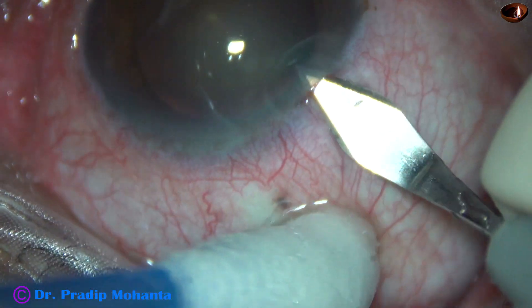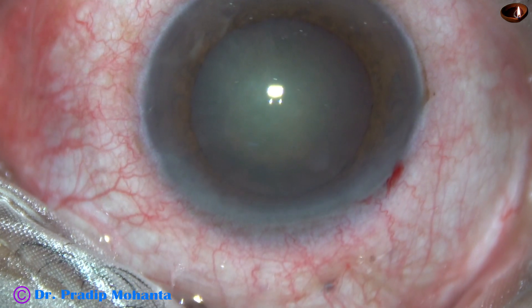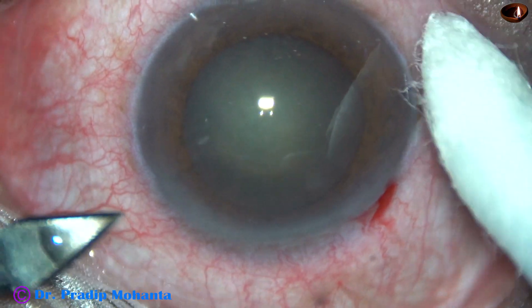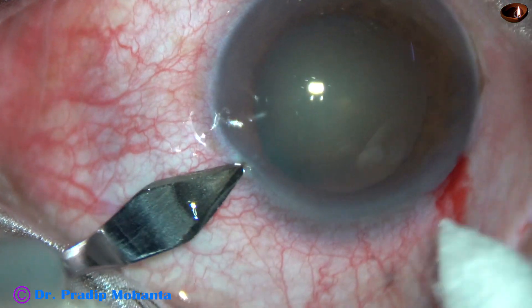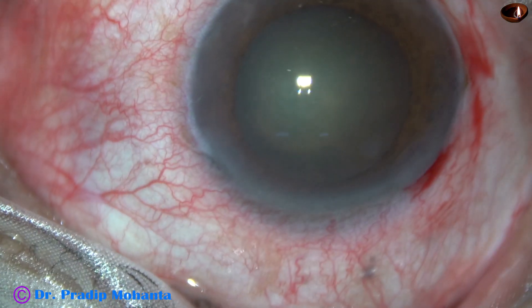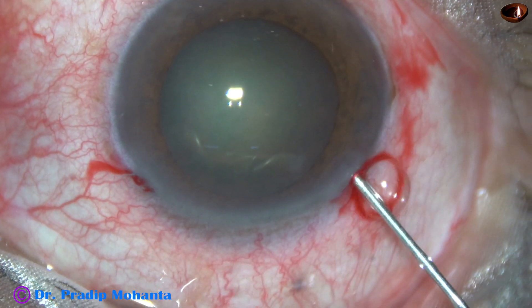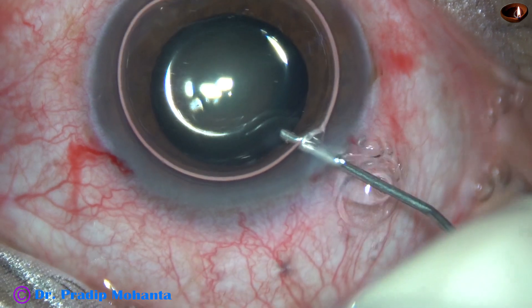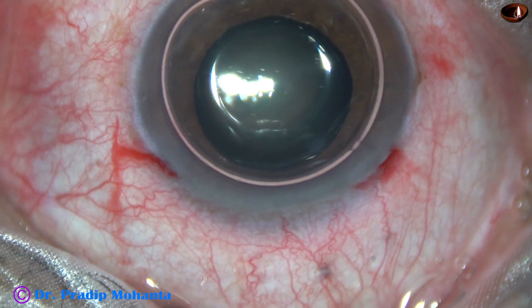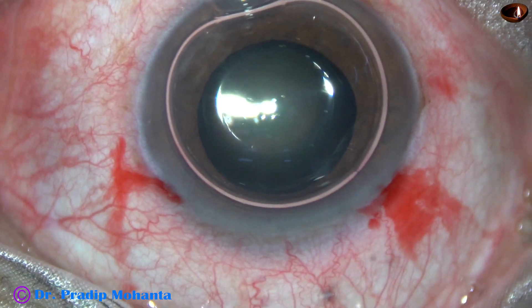This is the main incision with a 2.8 mm steel keratome. A sideport is made on the left side of the main incision, about 3 o'clock hours away — a very small sideport. Now I am going to stain the anterior capsule underneath this air bubble. Here goes the trypan blue dye.